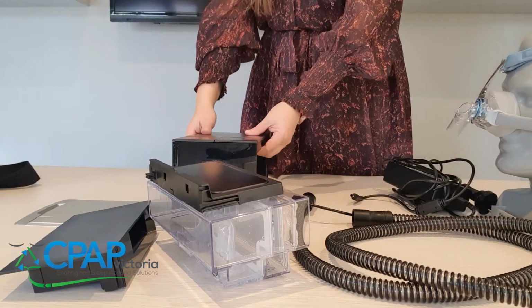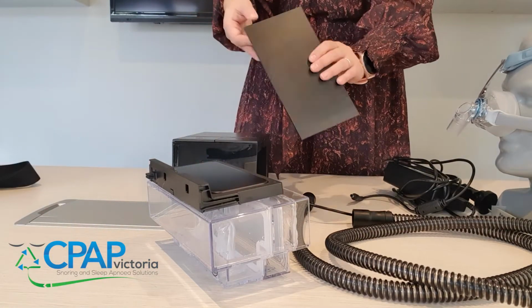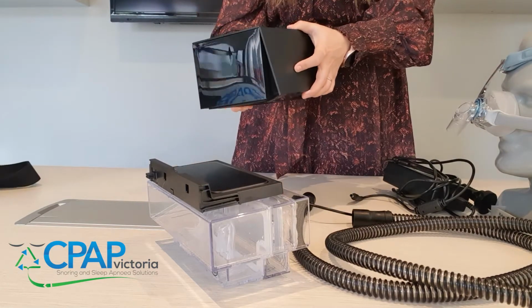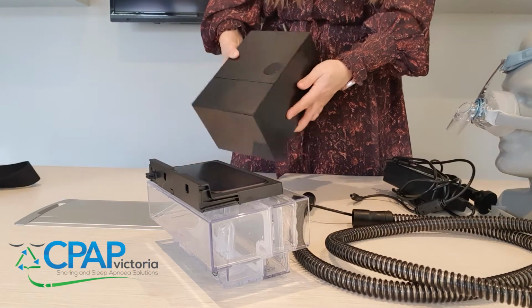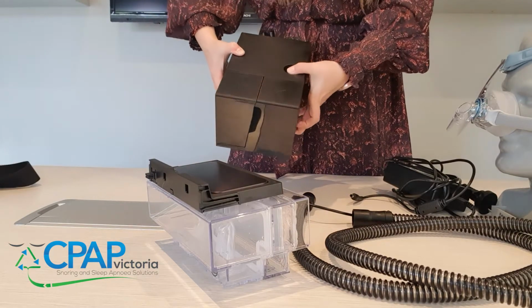Firstly, we're going to show you how to connect your side cover. This can be used when not wanting any humidification, which can be great for travel. To release this side cover, just press the button on the top and it will click out.